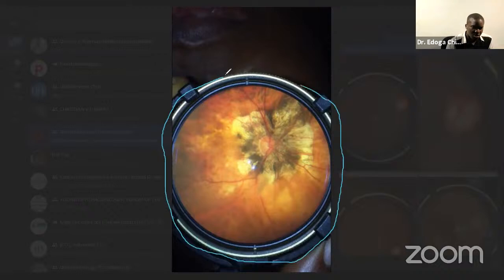I'll just discuss the importance of the adapter. Then in subsequent sessions, I'm going to introduce us to different adapters that you have. I will start with my own adapters. Possibly Dr. Emonia will talk about his own adapter, and then we'll also talk about the other adapters that are in the market. For me to have gotten this quality of images, I needed to use an adapter. So that's the third factor I'm going to discuss going forward.